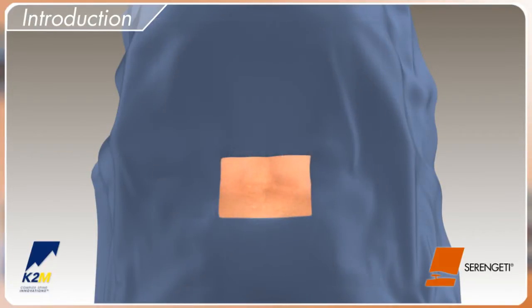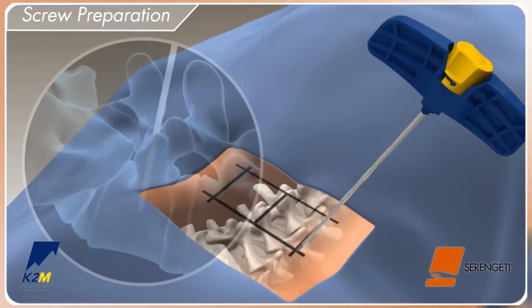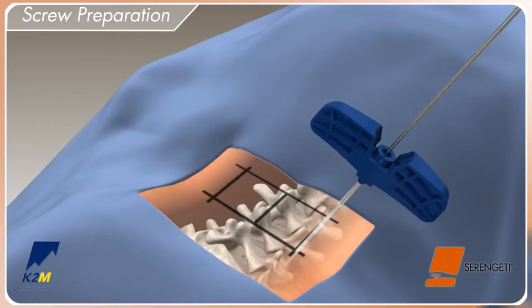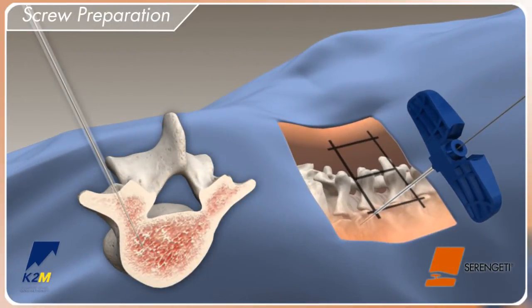Place the patient in a prone position, taking care to preserve the sagittal alignment of the spine. Use the pedicle access needle to locate the pedicle. With fluoroscopic guidance, advance the pedicle access needle to the desired depth within the vertebral body and remove the inner stylet. Insert the guide wire past the distal end of the cannula into the vertebral body.